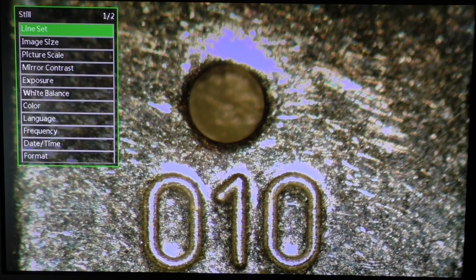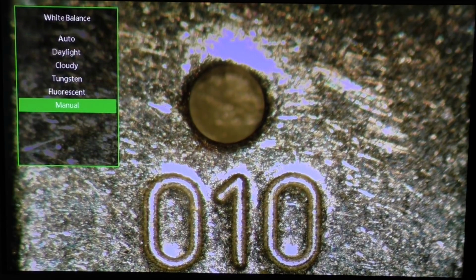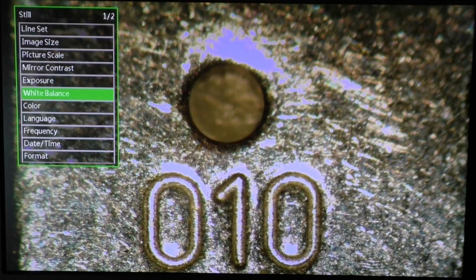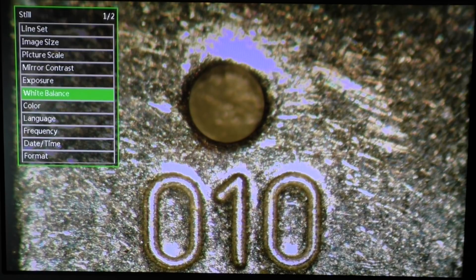Okay, then menu. White balance, that's something I had to set to manual, because I had to adjust it for the weird microscope lamp here, which is an LED. Normally you set that to fluorescent light, tungsten light, cloudy day, it's the usual settings that you have on a digital camera. So I think the chip inside is more or less from a standard digital camera, probably.